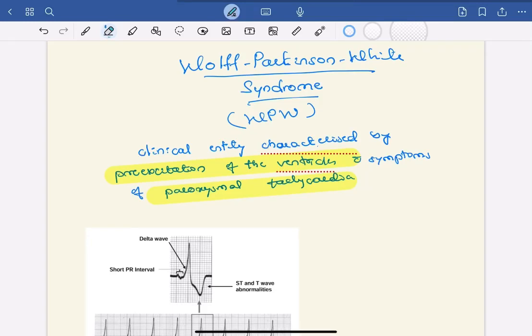Hello friends, in this video I am going to discuss one of the interesting ECG findings, that is Wolff-Parkinson-White pattern. So there are two terminologies, WPW pattern and WPW syndrome. What is WPW syndrome?